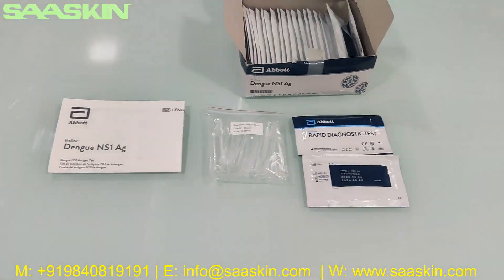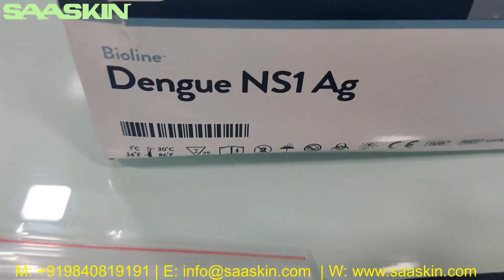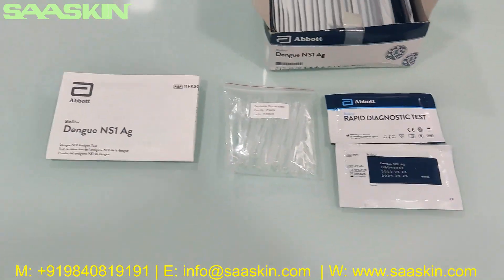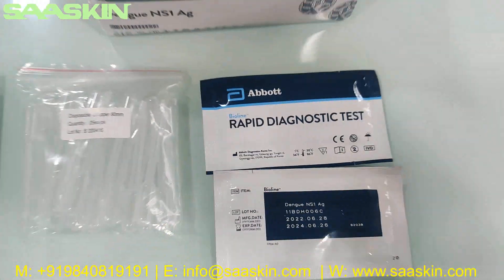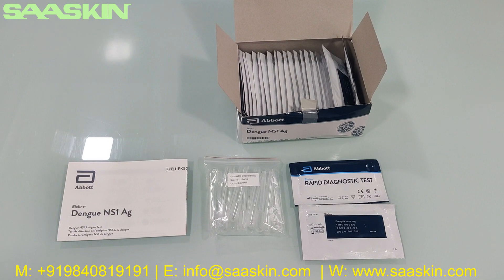To quickly summarize: today we have seen the unboxing of the Abort Wireline Dengue NS1 antigen test kit in the 25 test kit pack. In the pack you get one IFU instruction for use manual, 25 plastic droppers, and 25 test cartridges. This is how the complete test kit looks like. Thank you.